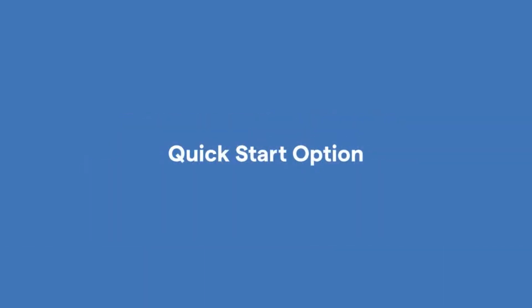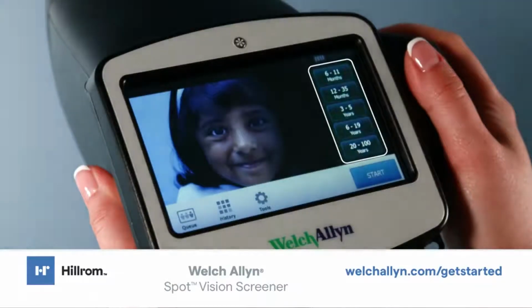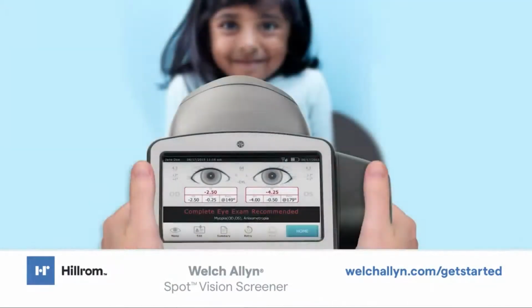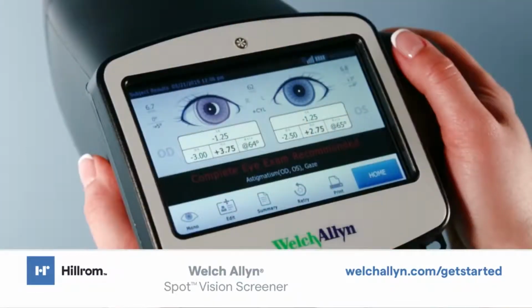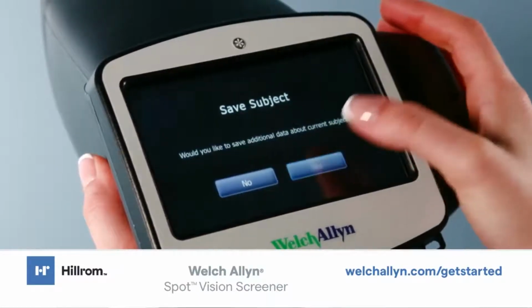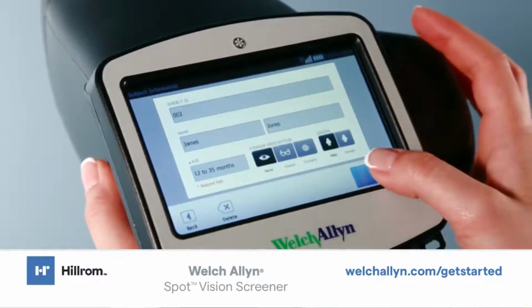Quick Start option. Select age range of subject, and the screening begins immediately. The subject results screen appears at the end of the screening process. Select Home and choose if you want to save subject. If saving results, enter the subject information as covered earlier in this video.